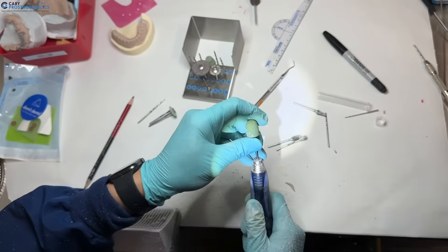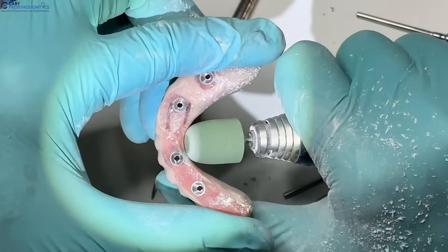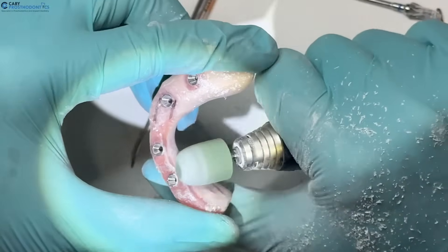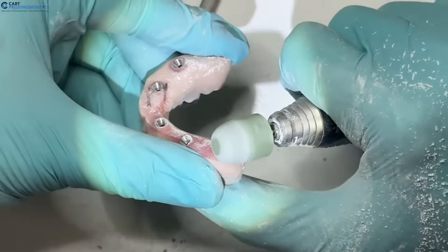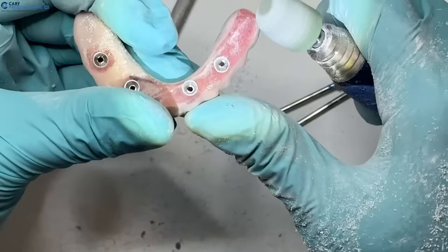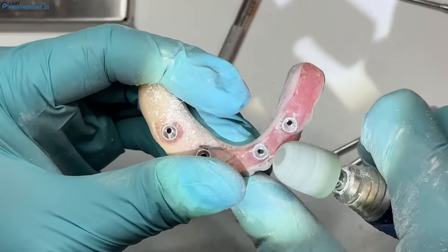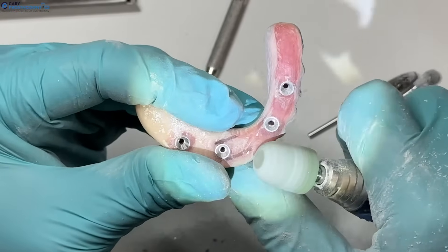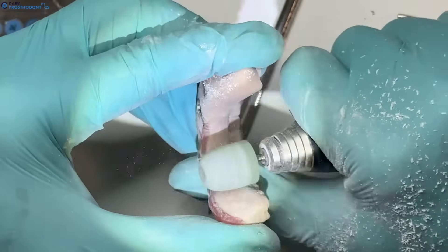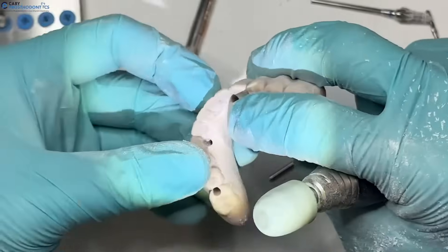The last polishing burr — the green one — is the big barrel burr. This is where we can really thin out the lingual side. You can really smooth this portion out. Always keep the burr moving. This is the distal extension — round that out. You can even come over where your pontics are. This burr is really nice for contouring — just run it back and forth.